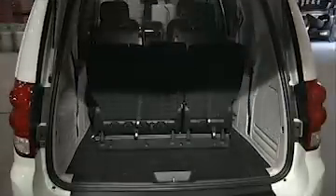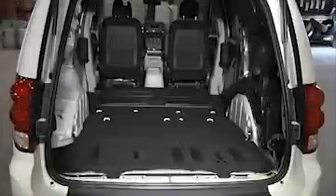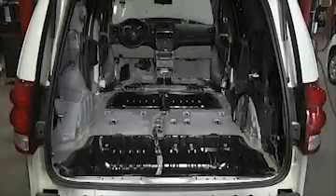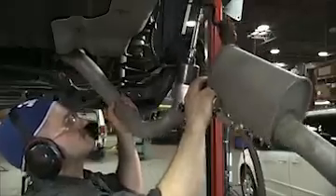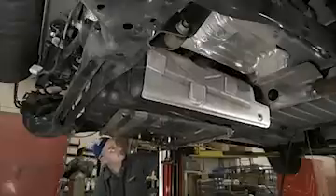The total revamp starts with the removal of the van's middle and third row seats. They pull out the carpet and completely strip the vehicle from the front seats to the back. Underneath, a technician saws off the exhaust system and disassembles the rear suspension. The entire undercarriage behind the engine is about to be reconfigured to make way for a new lowered floor.